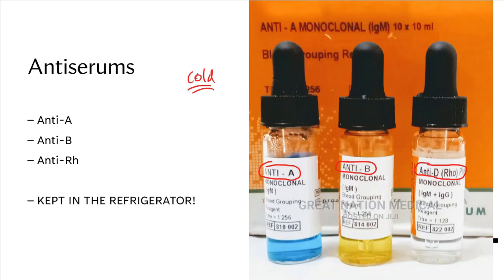So when you come into the lab and you're looking for these antibodies, you're going to find them in our refrigerator, where we keep all of our other reagents and chemicals. We have a designated section just for forensic chemistry, a couple of shelves in those triple door refrigerators, and you'll see that kept in a small basket. So grab it, let it come to room temp before you use it. After you get finished, do not leave it out. Put it back in the refrigerator, please. If not, it can ruin and it can spoil.